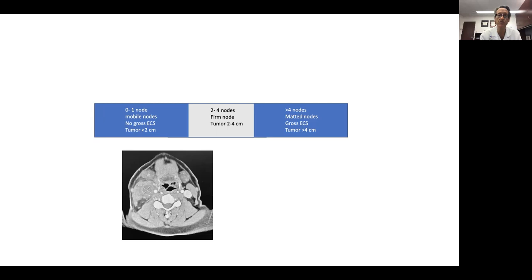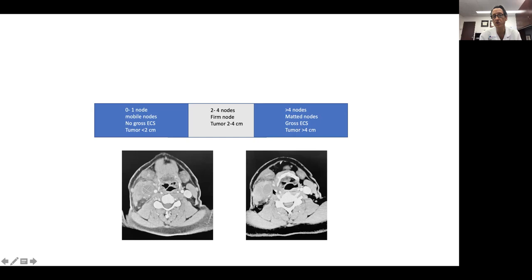But if you look carefully, you'll see there's dissemination and changes in the soft tissue that may or may not represent extracapsular spread. It may represent inflammation, but it's not as well portrayed in the straightforward reading from your radiologist. So not every mass and not every tumor is exactly as it may be depicted on our radiograph or report.